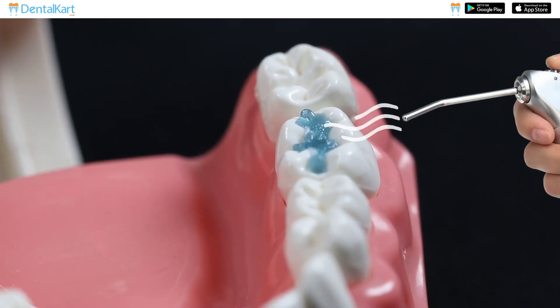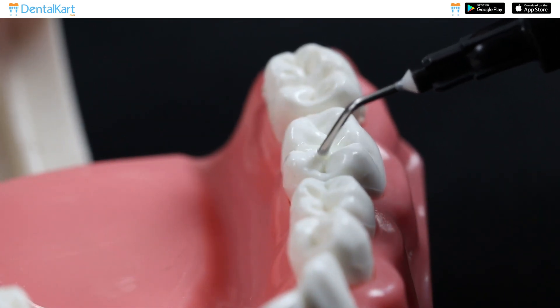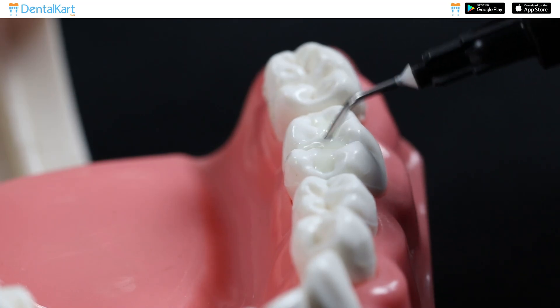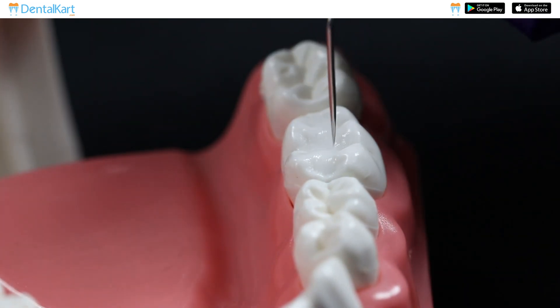Rinse and dry the etched surface properly before applying the sealant. Apply a thin, even layer of sealant material ensuring full coverage of pits and fissures. Cure the sealant with a dental curing light and verify the sealant's complete polymerization by checking its hardness and stability.